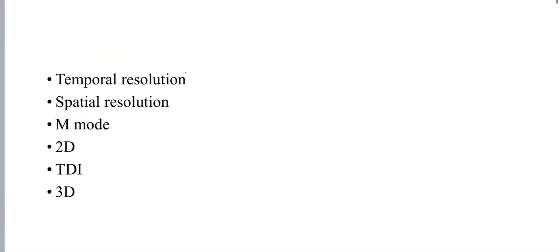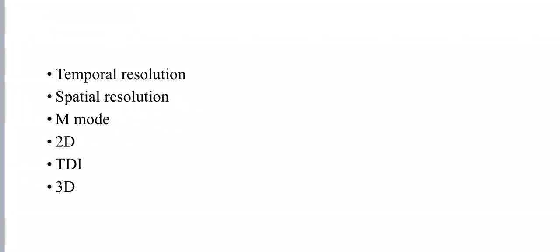Okay. Now, the temporal resolution is defined as what? So we have to know, what do we actually mean by temporal resolution? Timing. So any timing, what do you mean by timing? According to the cardiac cycle. You are so close. It is the ability of the beam to identify two points aligned in the same parallel beam as two distinct points. That is the spatial resolution. The spatial.